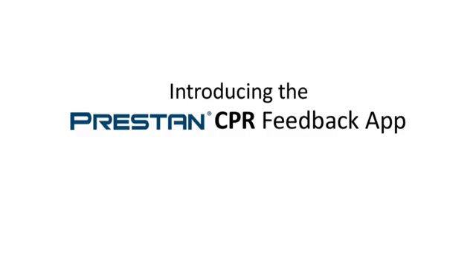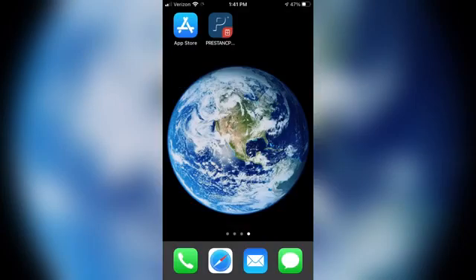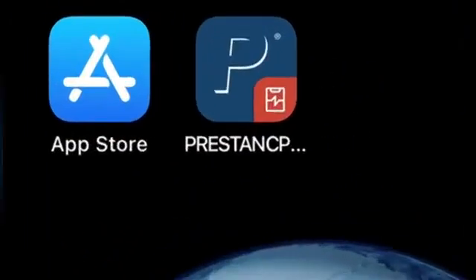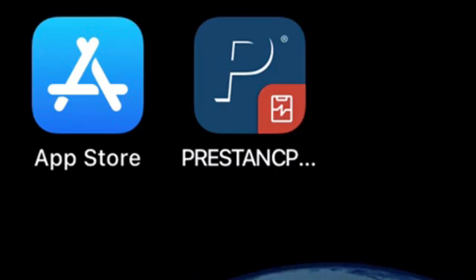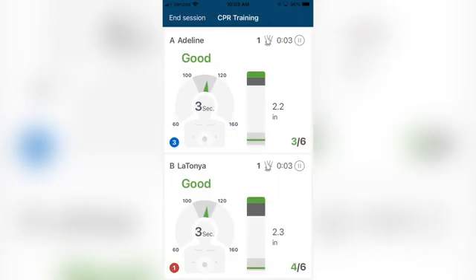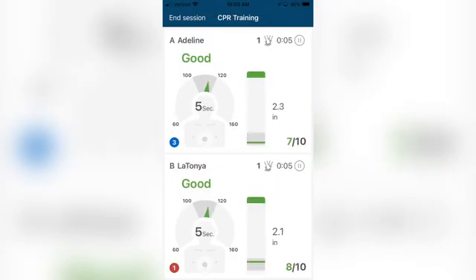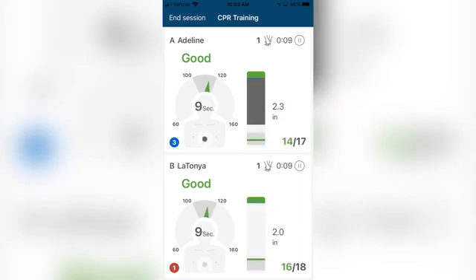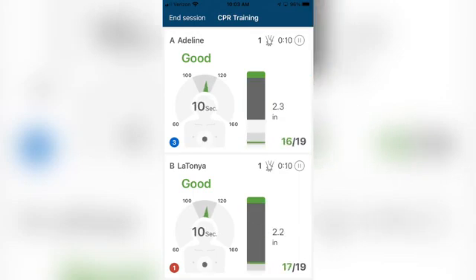Introducing the Prestan CPR Feedback App. The Prestan CPR Feedback App provides high-quality, real-time, advanced CPR feedback via a Bluetooth connection when combined with the Prestan Professional Adult Series 2000 Mannequin.